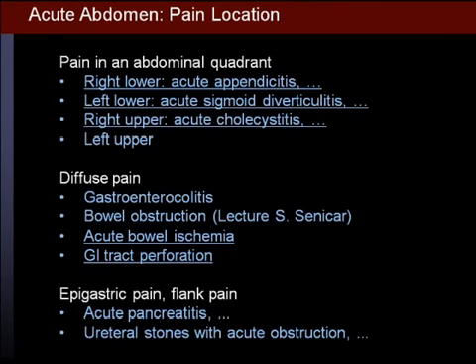Diffuse pain, the most common causes are listed here, and the causes of epigastric pain and flank pain are listed here. Now I have underlined all the pathologies which I will discuss in the next 25 minutes or so. An important cause of diffuse pain is bowel obstruction. You have heard about bowel obstruction yesterday in the excellent lecture of Dr. Senica, so I will not address this topic in my lecture.